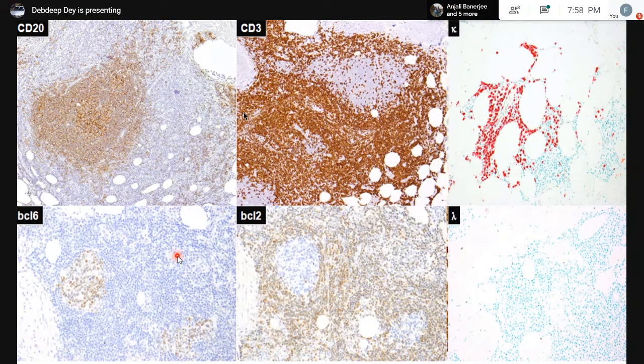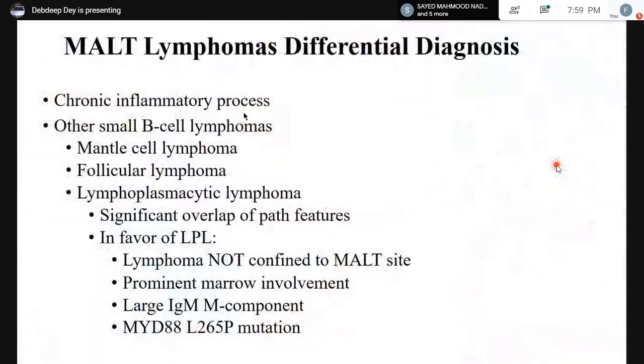follicular lymphoma. And the CD3 is quite present in predominant numbers, but what tilted the balance was this kappa and lambda, which showed a light chain restriction here. Thereby the combination of CD20, BCL2 along with kappa lambda restriction is sort of confirmatory of a marginal zone lymphoma.